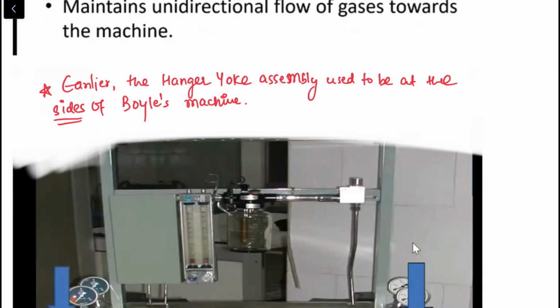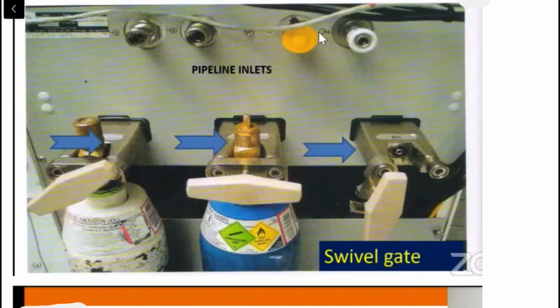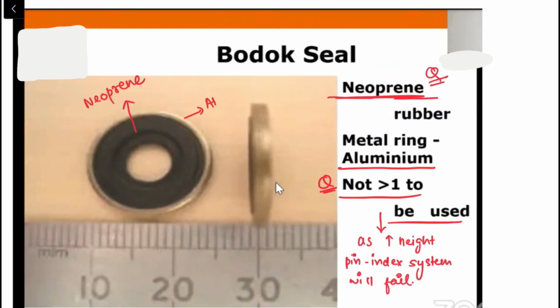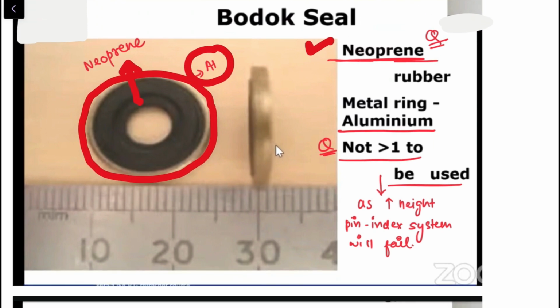These are the functions of the yoke assembly. Not very important. The yoke assembly you already know now. The gate is actually known as the swivel gate. The Bodok seal is made up of neoprene rubber, and this is the neoprene rubber, and around this you can see there's the aluminium ring. This is the aluminium ring.